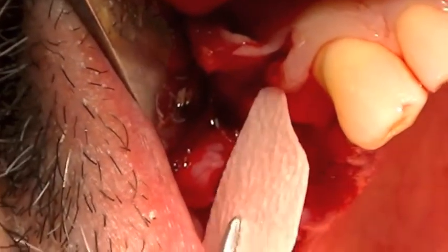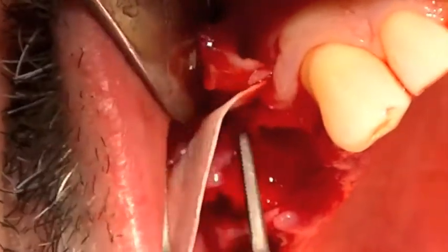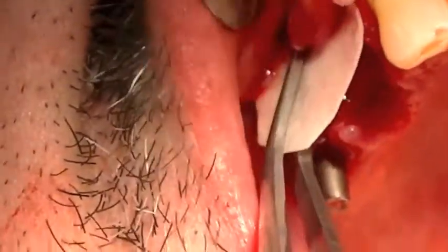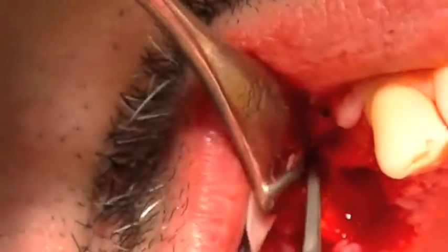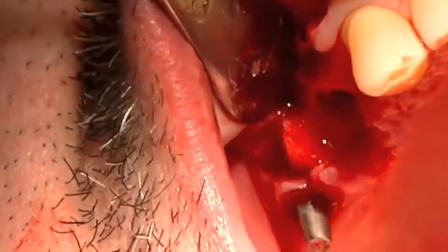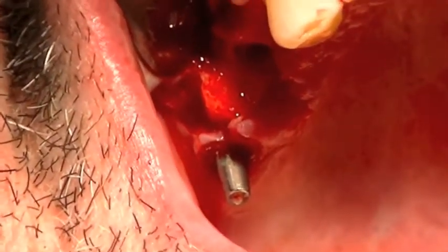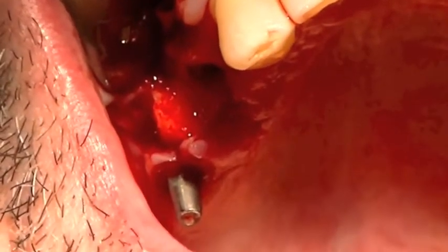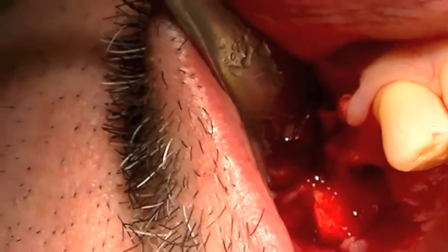We're going to use a resorbable membrane cut to the proper size. What I do first is engage the bone surface at least two millimeters on solid bone. So I'm putting my resorbable membrane on first, then I'm going to take my allograft material, which has been wetted with sterile water — sterile saline; in this situation it was sterile water — and we create kind of a putty-like consistency.